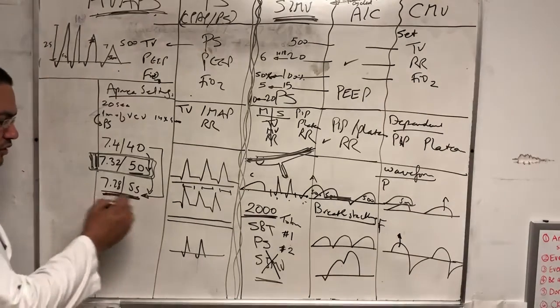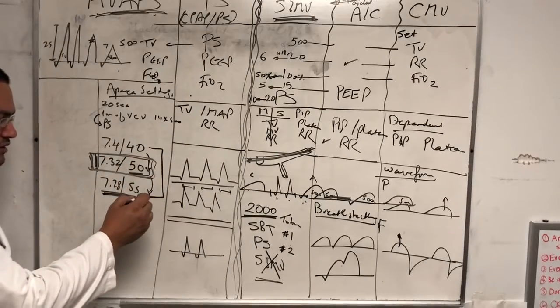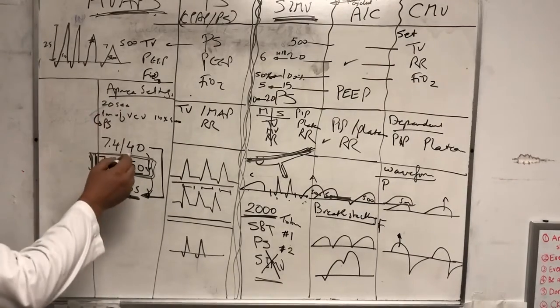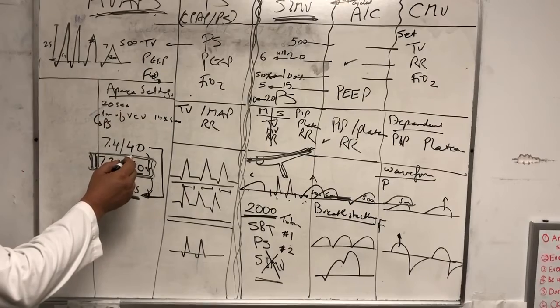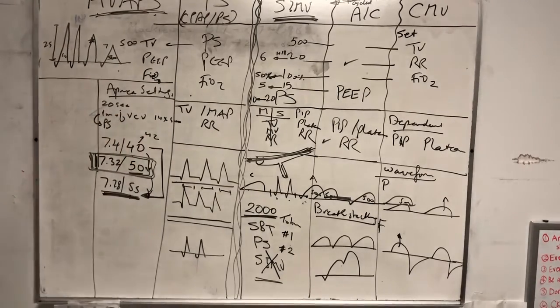So anyway, every minute I'm going to raise it only by 6. So I need about 3 minutes or so to reach here. But in 20 seconds, the vent is going to say, he's not breathing. I only raised this to 42 or something. This one is going to say he's not breathing. Let's give him 1 minute of AC. We'll wash out the CO2 that he made, and then we'll put him back again at the same level that he started with. So he does it again. So it becomes a vicious circle.